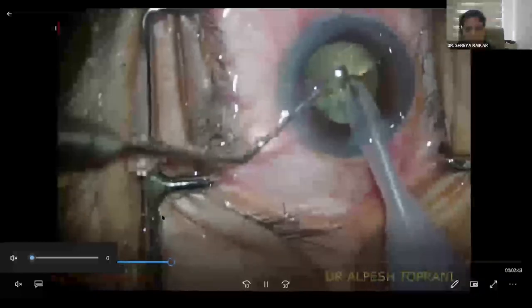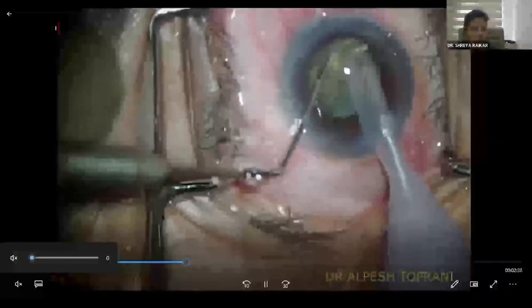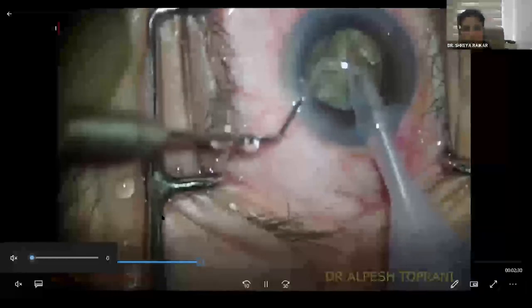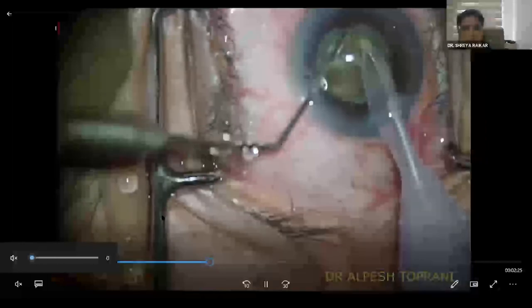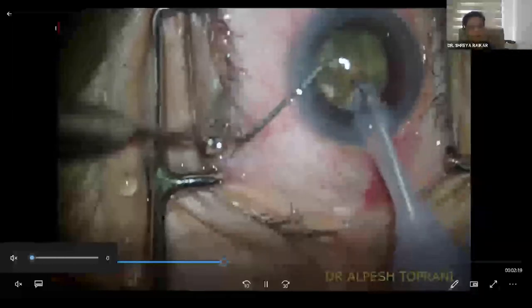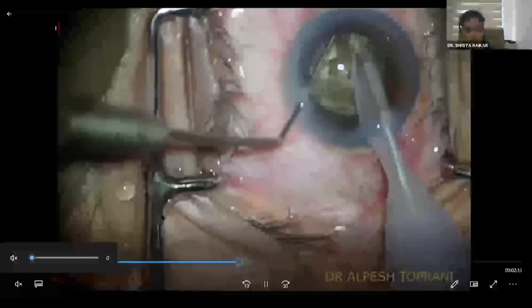Phaco emulsification of hard cataracts is usually considered difficult and challenging because in these cases, the nucleus is very hard and division into 5 to 6 pieces becomes a little difficult. And moreover, there is no epinuclear cushion which will protect the PC. Hence, the chances of PCR are more because in a mature cataract, the PC is thin and even the epinuclear cushion is not there. And another aspect is weak zonules in mature cataract. Since usually these patients are old, the zonules are weak.